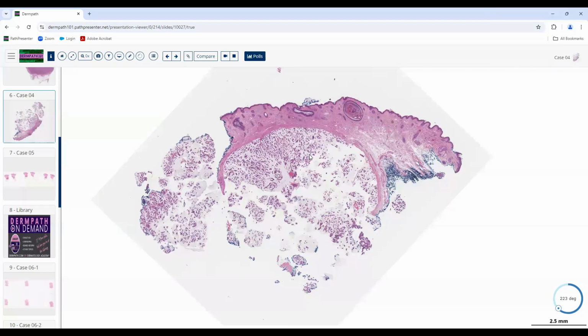I was just going by the symmetry and the organization. I was feeling more that this is a malignancy. Yeah, I agree. It could very well be malignant. Now, it does have a fairly well circumscribed morphology up here, but then it goes to the base and what's going on over here? That might be a sign of poor circumscription. So we've got some conflicting criteria.